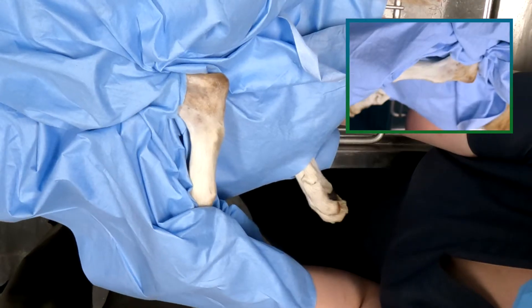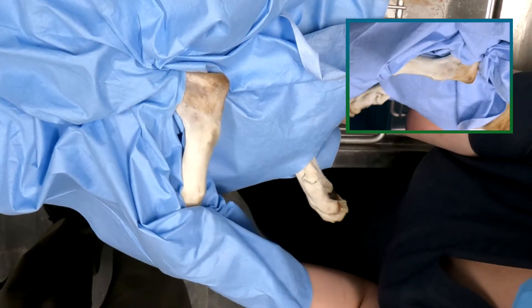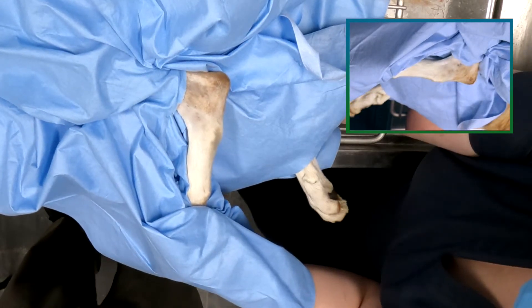To perform a canine tarsal joint injection from the dorsolateral approach, begin with the limb in neutral.